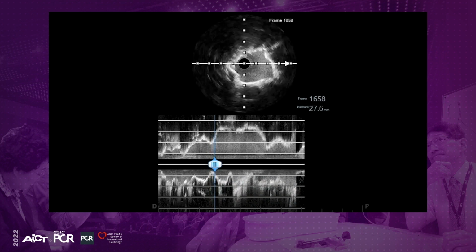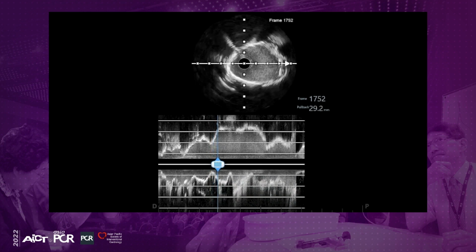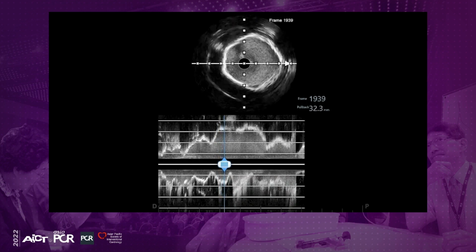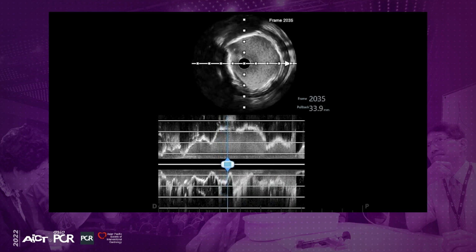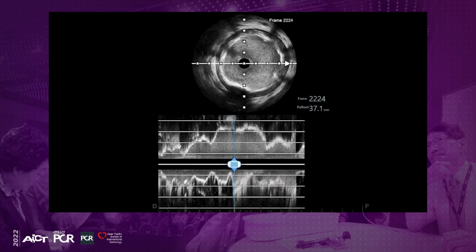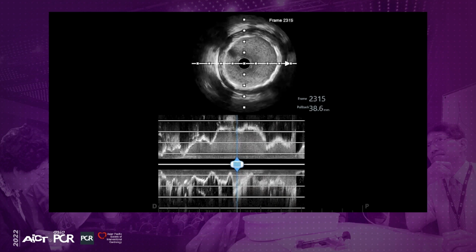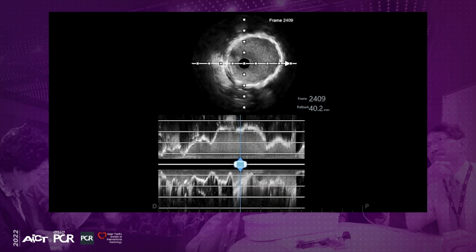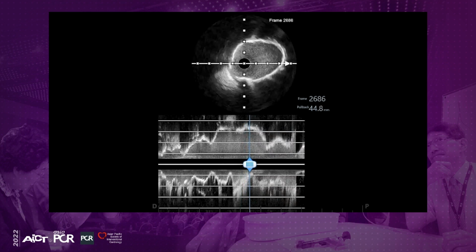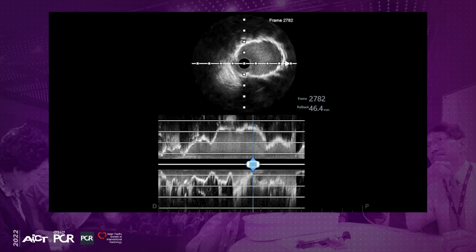What we want to achieve is symmetrical stent expansion, and you can only achieve that if you have adequate fracture of the calcium plates. Otherwise, you're going to get an asymmetric stent expansion. Like in this frame here, part of it at the 8 to 10 o'clock position, but most of it is actually pretty well expanded and symmetrical. What you get is a circle, which is what the vessel should be.